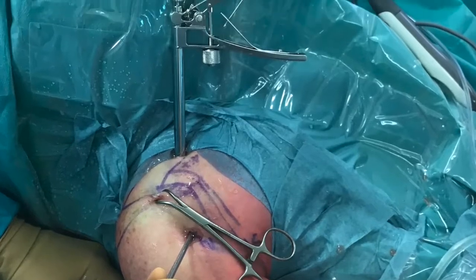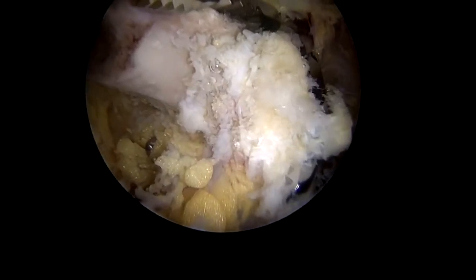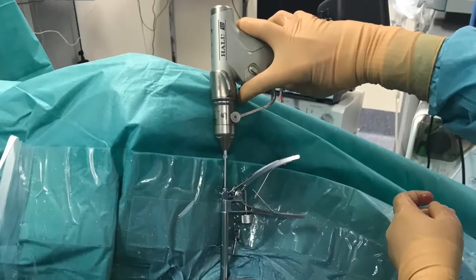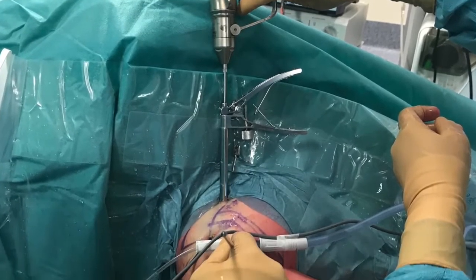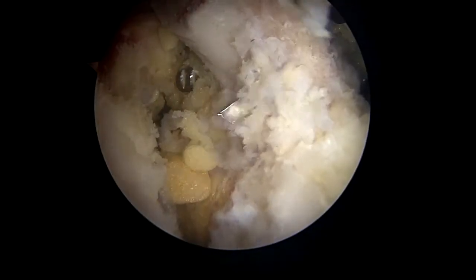Once the osteotomy is completed, the coracoid process drill guide is introduced via the north portal and positioned over the tip of the coracoid process. The hole is drilled under direct vision and the central drill is removed, leaving the outer drill cannula in situ.